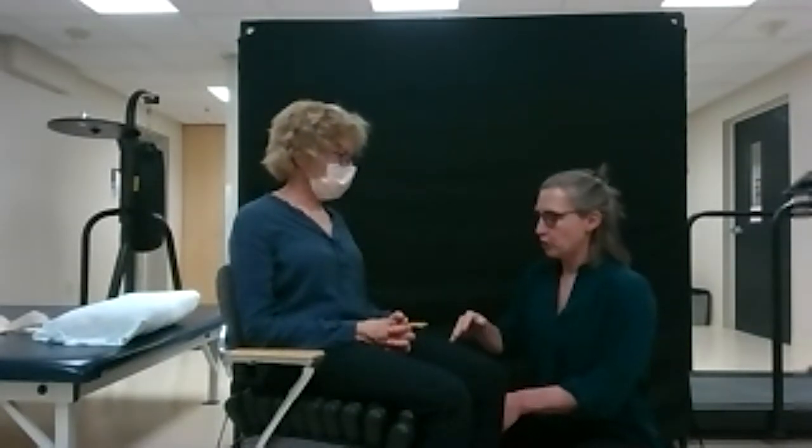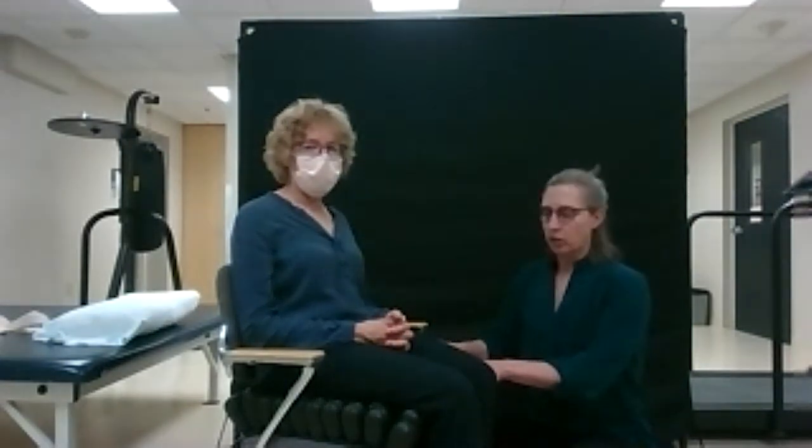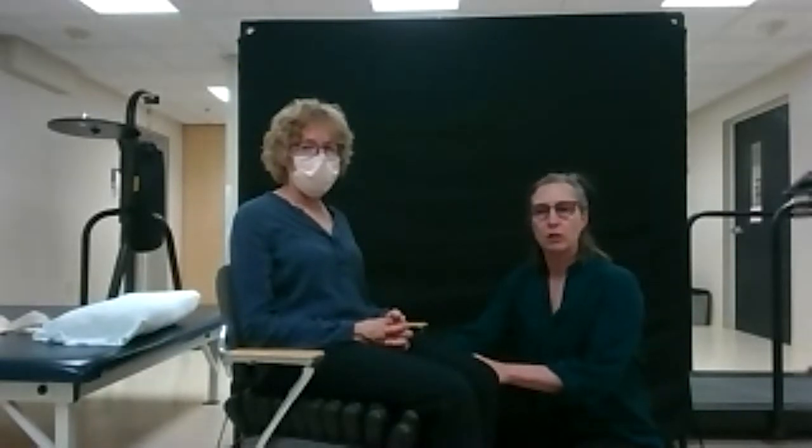After we have let it equalize the temperature and the pressure, we want to make sure the individual feels comfortable. If they feel like they're sitting too high, just open the valve and let a little bit of air out. If they are sitting too low, we can add some air. What you're looking for is comfort — take your hand underneath the individual's tailbone, which would be the bony part or sit bones at the base of the spine on either side.